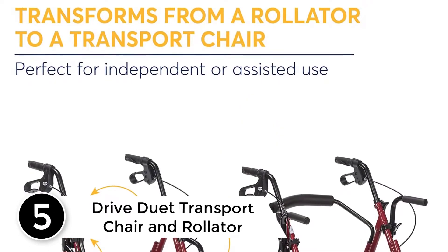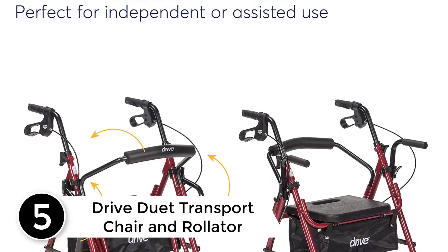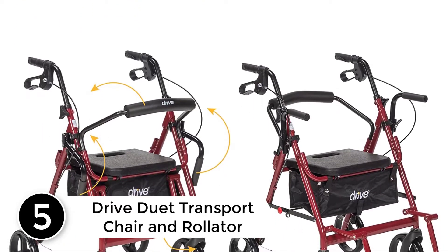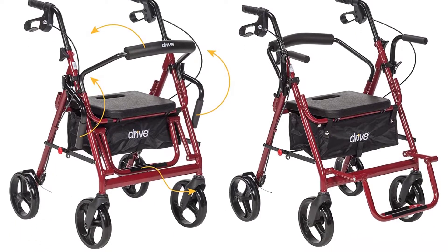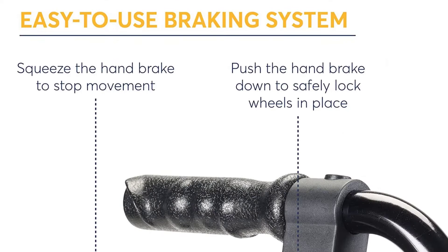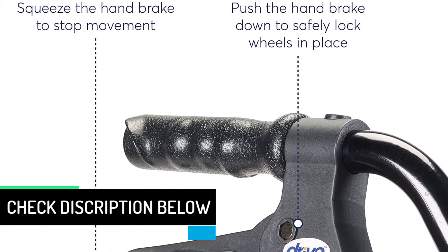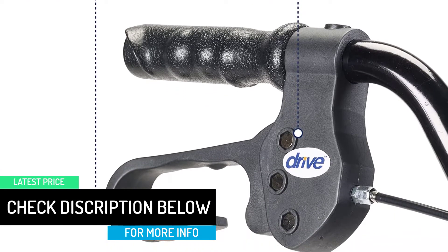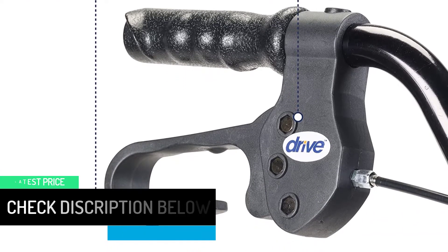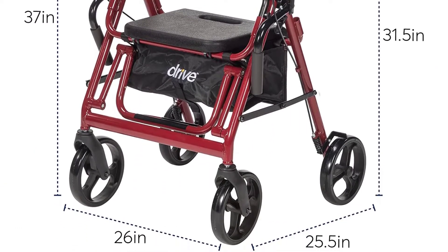Starting at number 5: the Drive Duet Transport Chair and Rollator. The combination rollator and transport chair functionality makes this pick a great value for your money. We also like that it comes in your choice of red, blue, or black frame. Many rollators come in only red or blue, so the black option is a nice addition. This model also features locking, flip-up armrests for use while seated, which adds an extra layer of comfort and support.